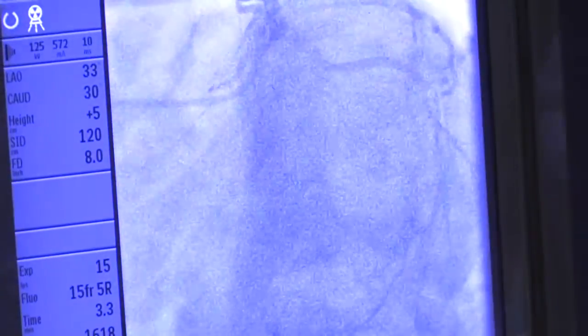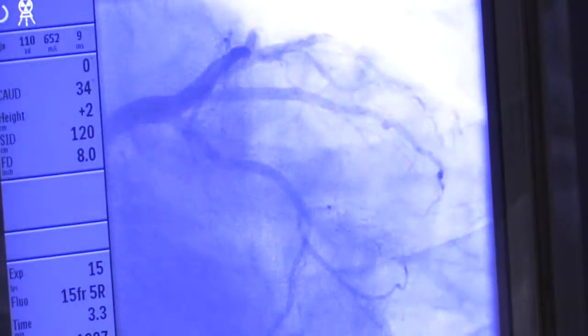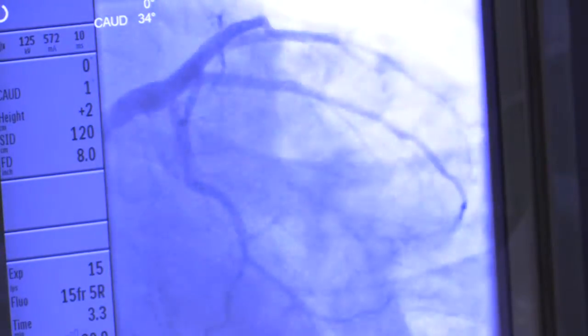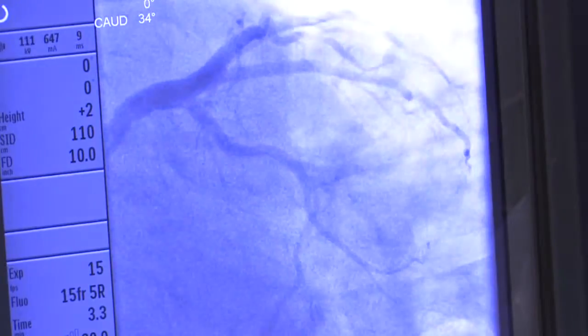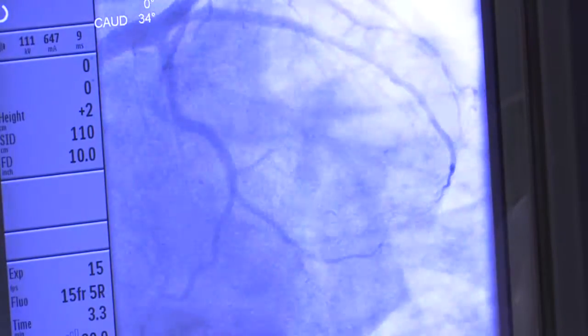So far it's looking good. You see the black that looks like a little pipe — when there's a blockage, you'll see a little bite out of that, like an hourglass. That's where the cholesterol plaque is blocking the artery, so you don't see a full, healthy, large channel like you do in this gentleman. Before we remove the catheter, we're going to review everything very carefully and make sure we haven't missed anything.